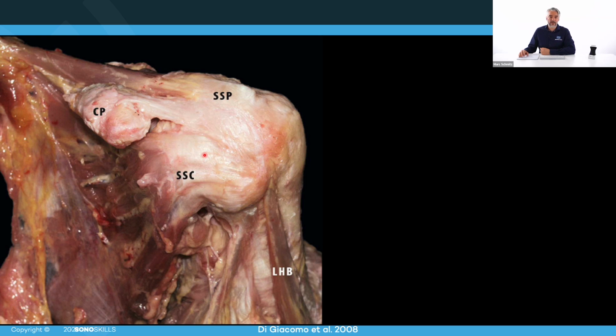And then also a functional assessment looking at the subscapularis in relation to the coracoid process, where you might see an impingement in the coracohumeral outlet, impingement of the subscapularis tendon, or maybe also a bursa, which could be the subacromial or maybe even the subcoracoidal bursa.